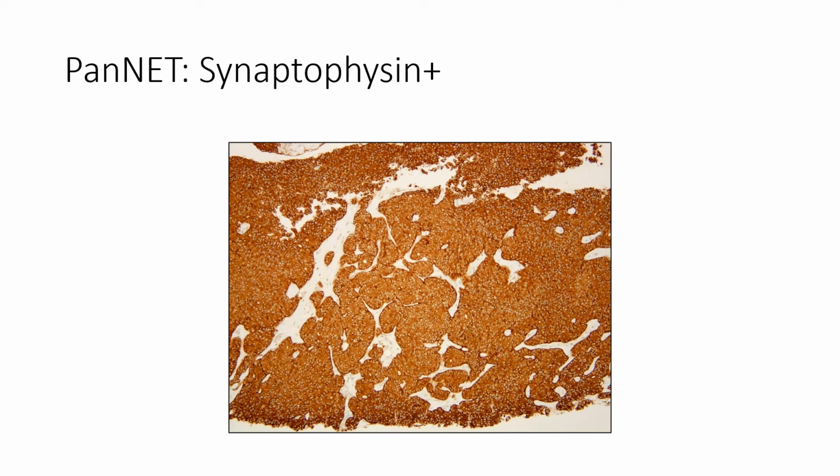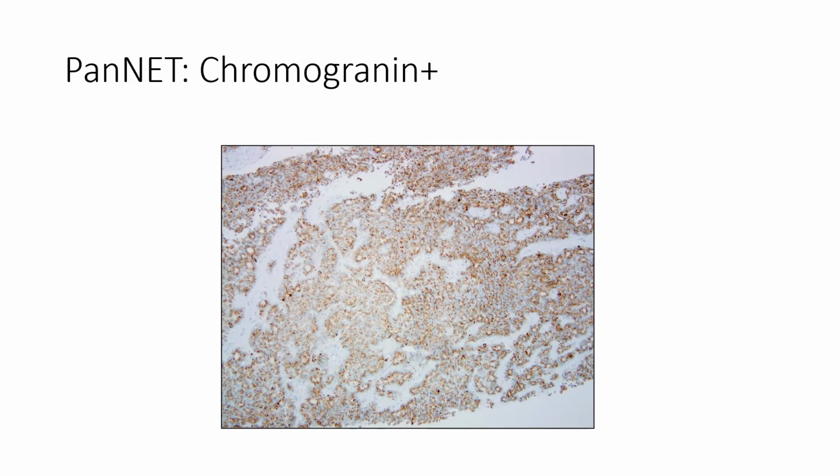PanNET is strongly positive for synaptophysin. You can see the strong, diffuse positivity for synaptophysin. And here we can see moderate positivity for chromogranin.